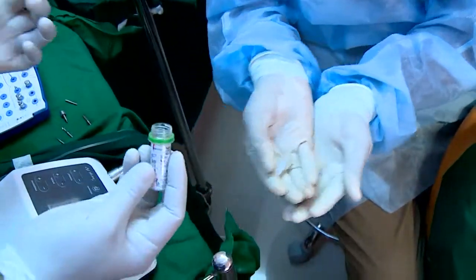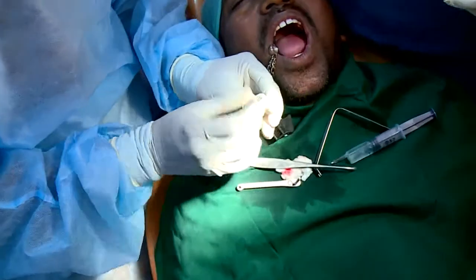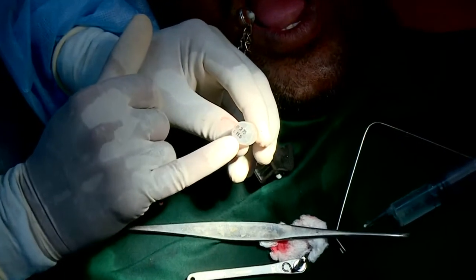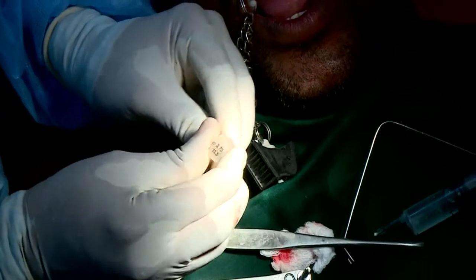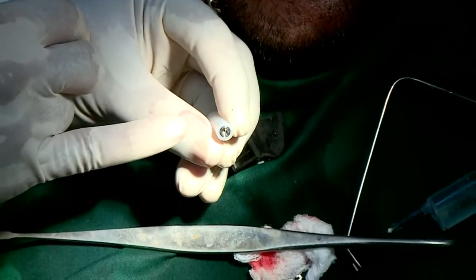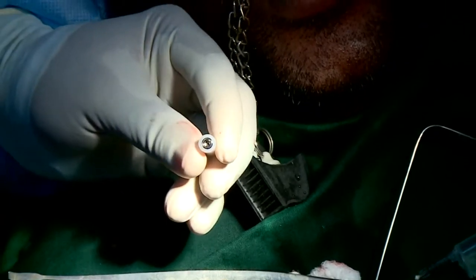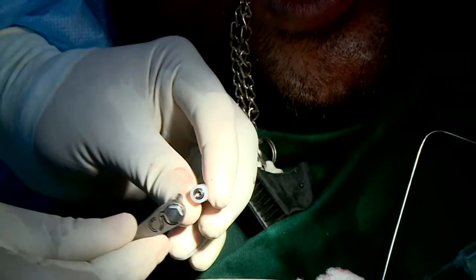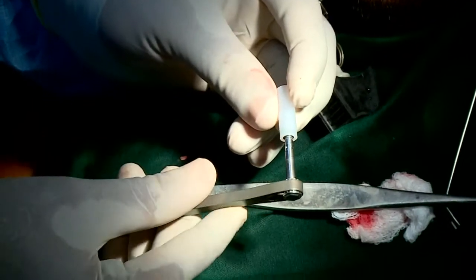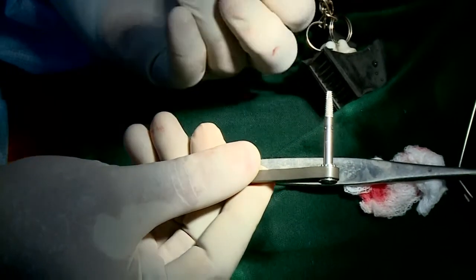So this is the inner container. Thank you. Now you can see, this is a sterile container. It says 3.75, that's the diameter, and 11.5, that's the length. So when I open the outer one, you can see the implant's inner surface. Can you see that? Yes, sir. Right. So now this implant driver can be fitted onto it. So you don't touch the implant, you just take it out, you see the implant.